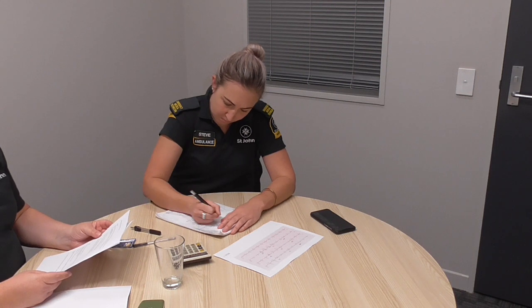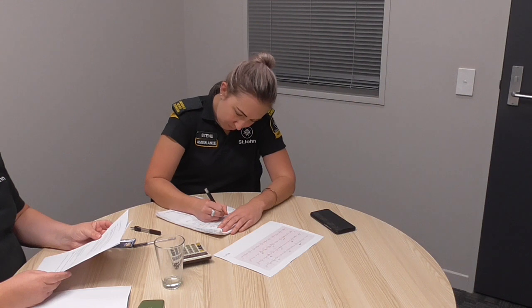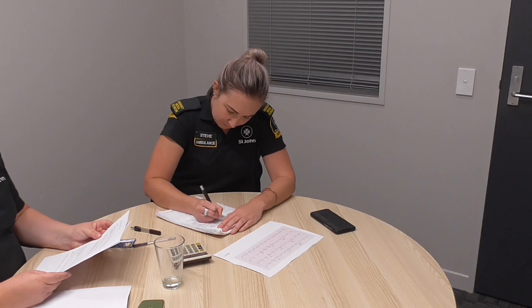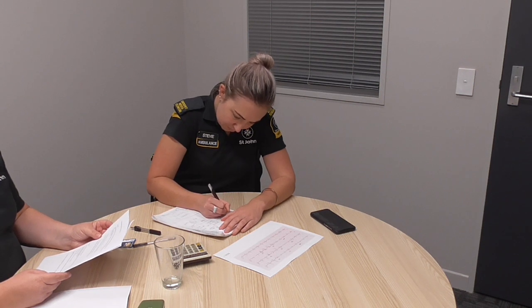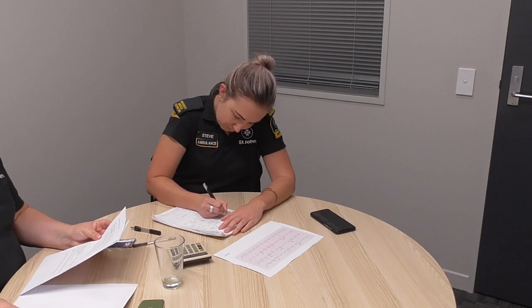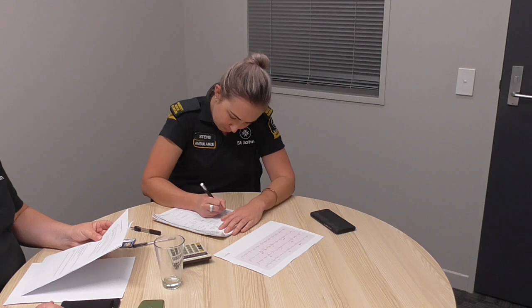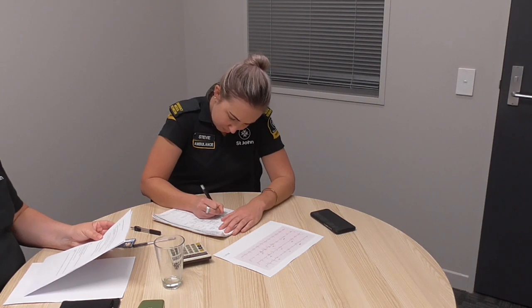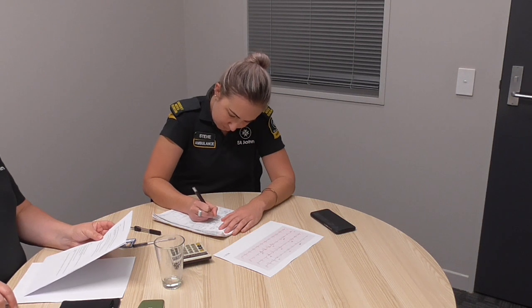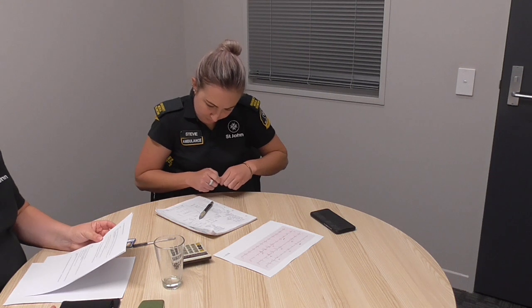He's got a history of angina. He takes aspirin, metoprolol. I've got some vital signs for you. Blood pressure is 140/90. CRT is 2 seconds peripherally. He's got a respiration rate of 16. Describing his pain as 7 out of 10. So you've got 7.5 minutes to now interpret the rhythm in front of you, and then I'll ask you some questions about that. Okay.